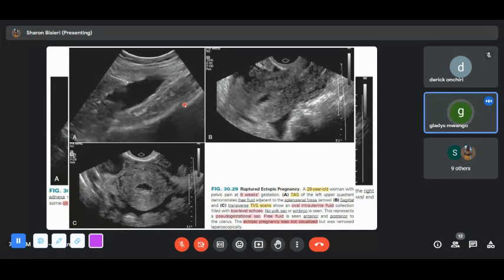Did you ask? Because it's always good to ask. Always get a history from the patients because you are there with the patient. Remember the clinical background. Get a history from the patient, and then you can tie everything together, because when you have differentials, if a pregnancy test is negative, then another differential for free fluid in the endometrium would be what?